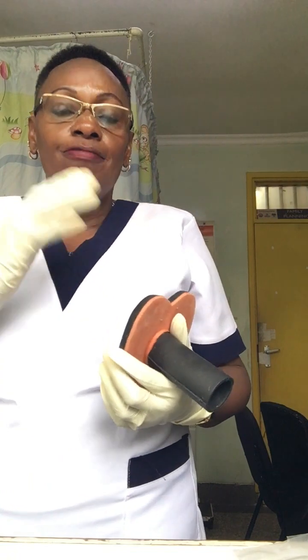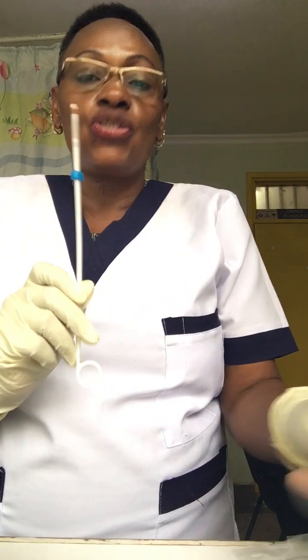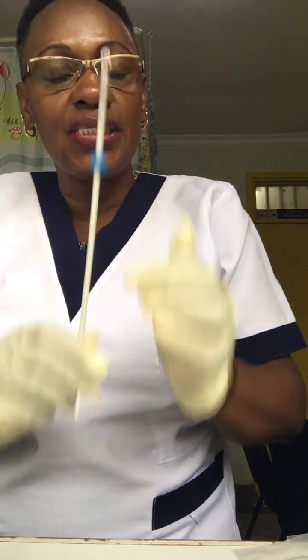Before insertion, we explain the procedure to the client. I have already shown you how the IUCD looks. This is the introducer. The IUCD is here, and this is what helps the health professional to push it inside through the vagina, the cervix, until we reach the uterus to give you protection.